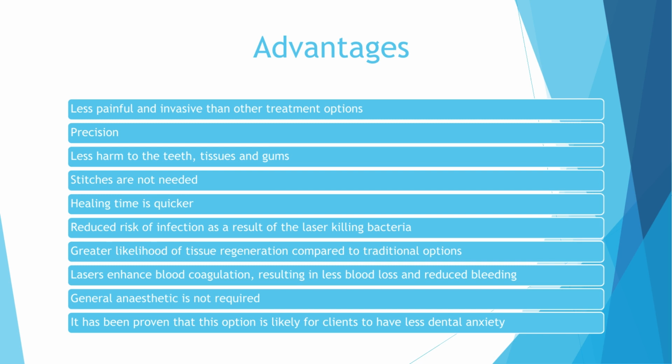So next we're going to be talking about some advantages. When compared to manual scalpels and other dental instruments, dental laser provides several advantages. These advantages include that the process is overall less painful and invasive than other treatment options. With lasers for periodontal use, unhealthy tissue may be precisely targeted and removed, leaving healthy tissue unaffected. There is less harm to the teeth, tissues, and gums.